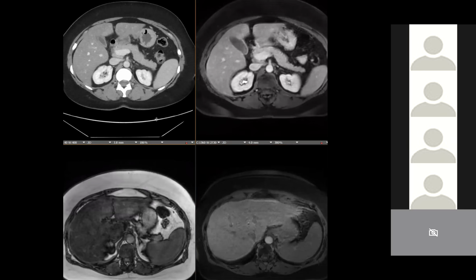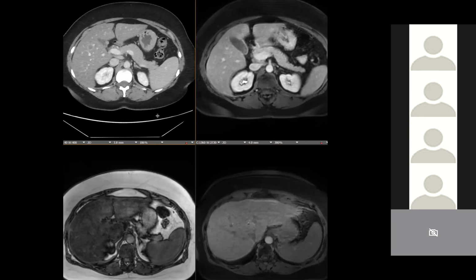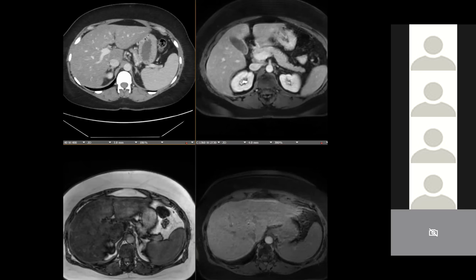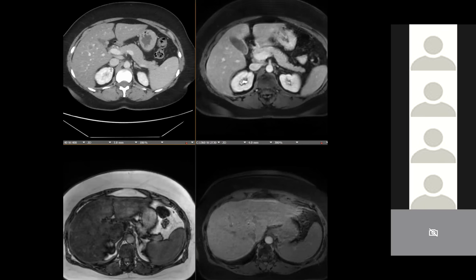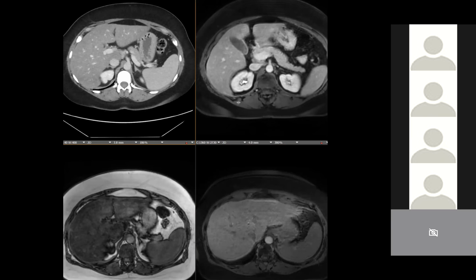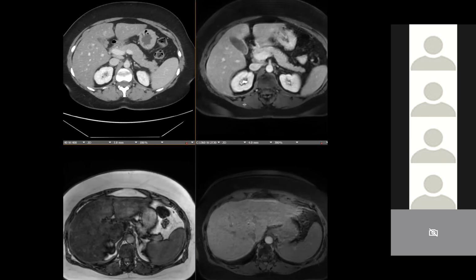She said it's just a pitfall, and the pitfall is patients with breast cancer or colorectal cancer who have background steatosis. Our ability to detect metastases is limited, and in these cases they usually harbor many more metastases than what we can see on CT because of background steatosis, so we should really be recommending MRI with Eovist to fully characterize the extent of metastatic disease in patients specifically with colorectal and breast cancer.